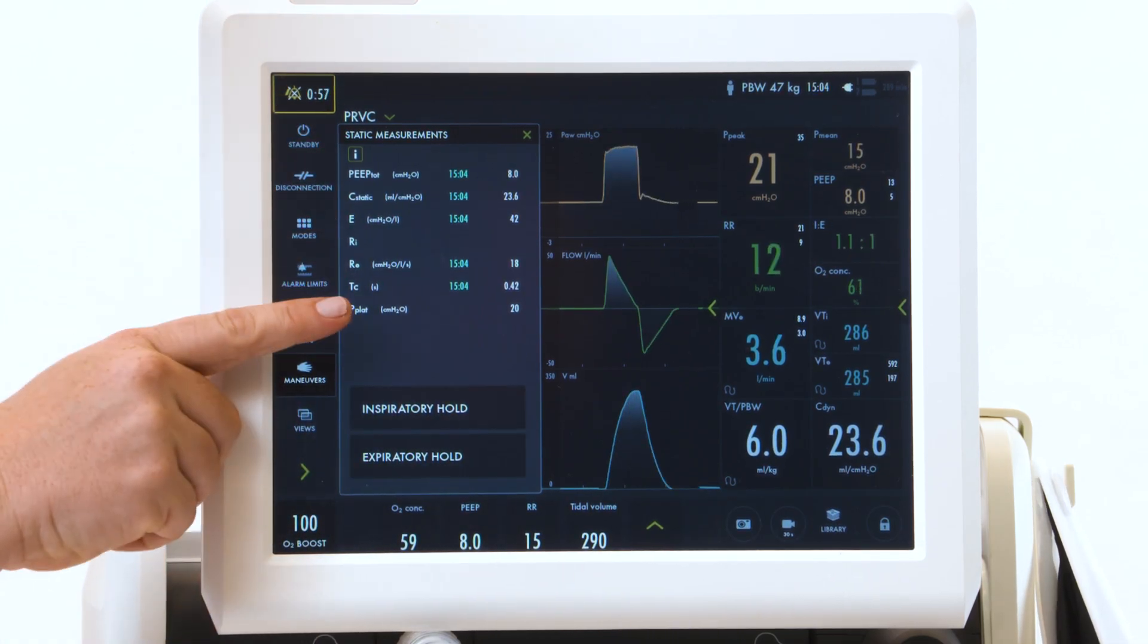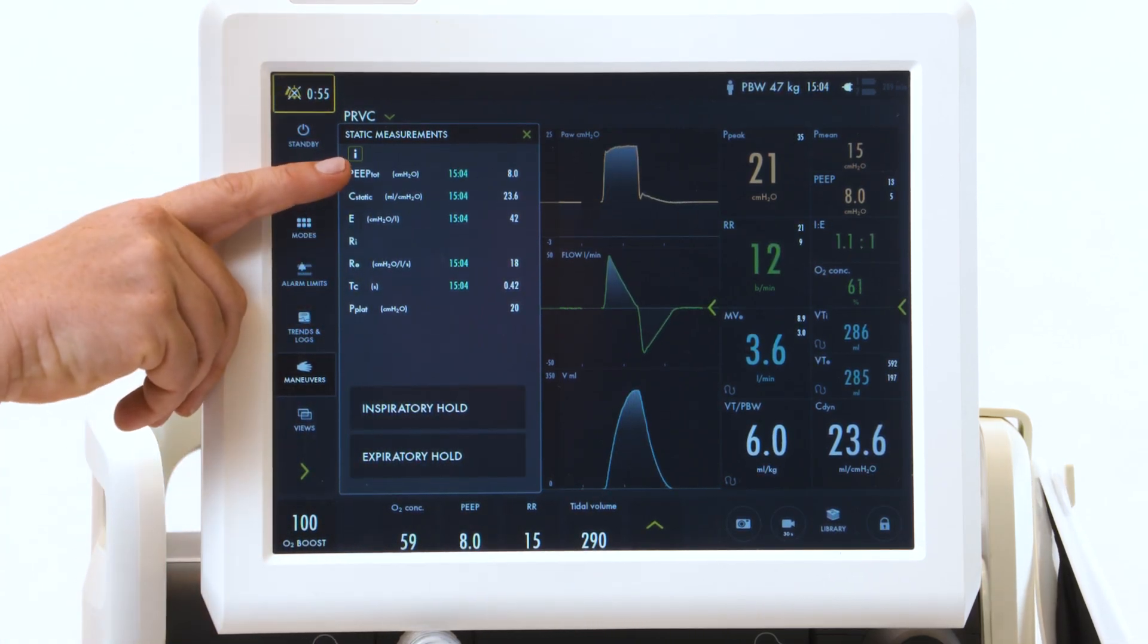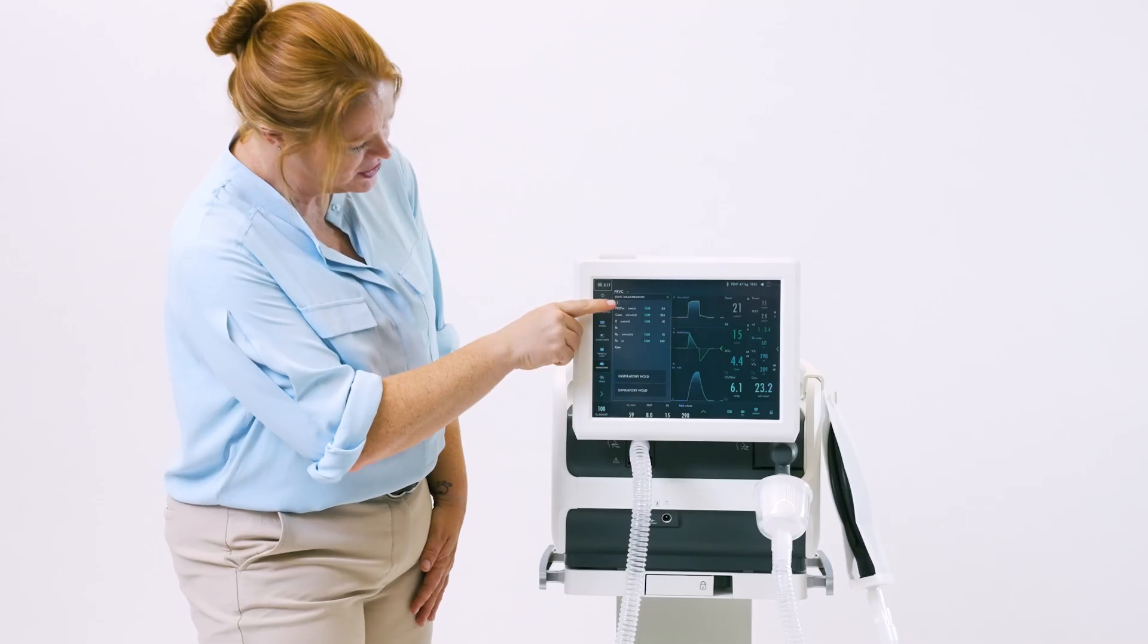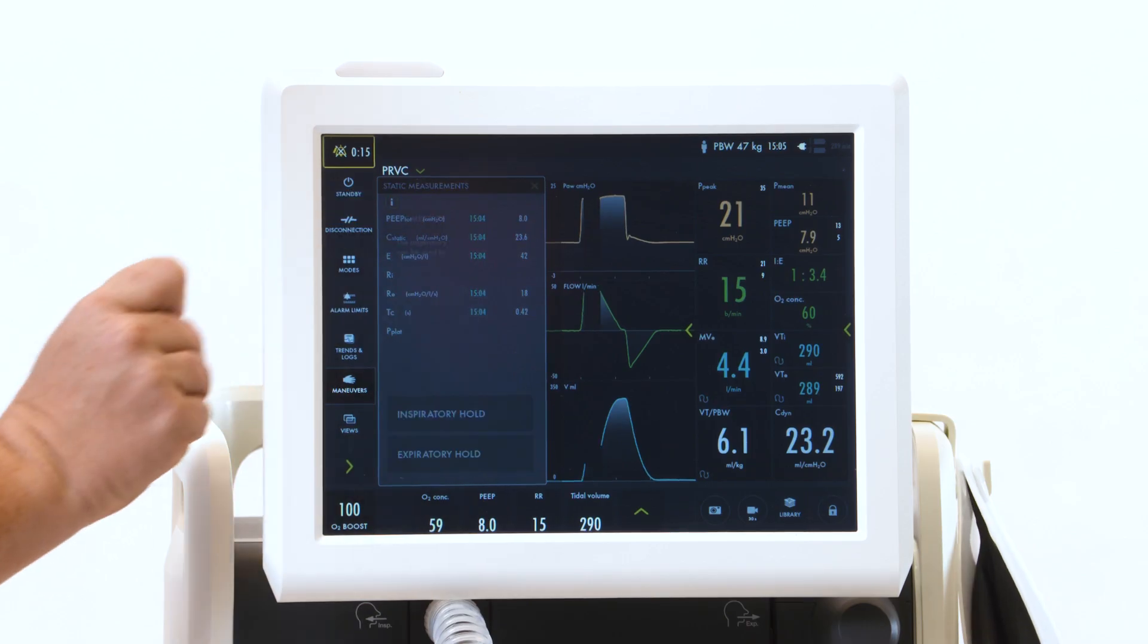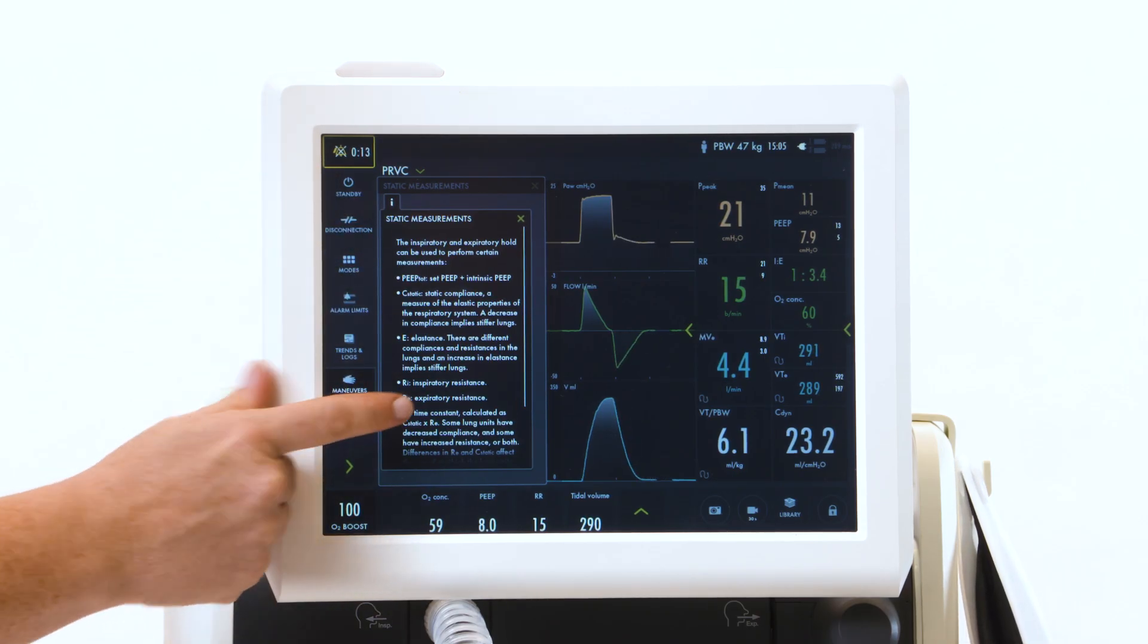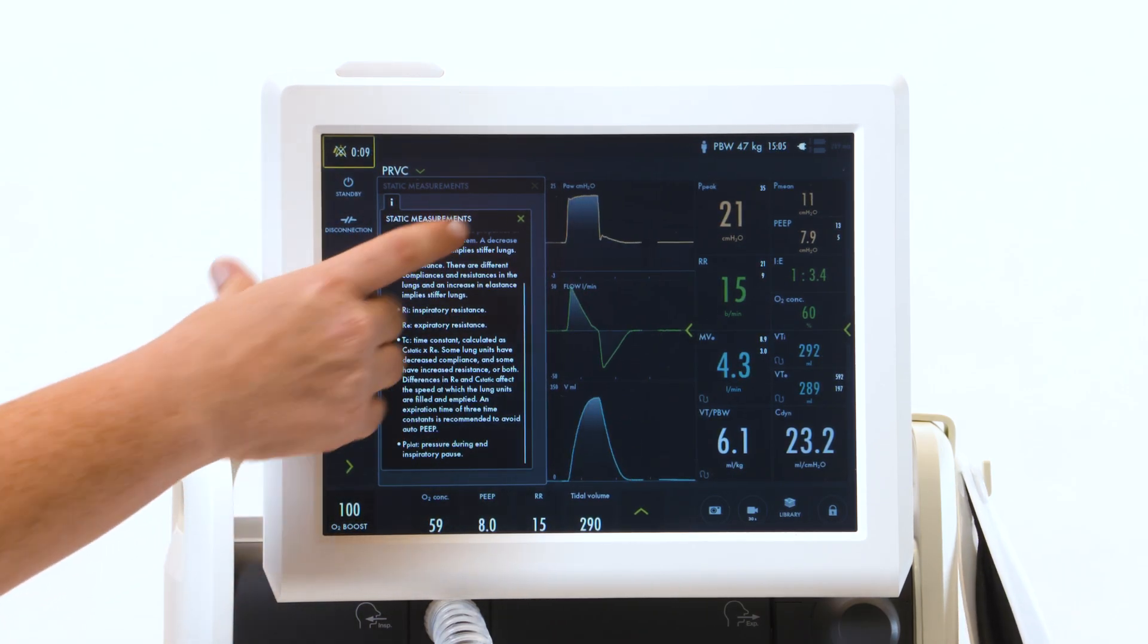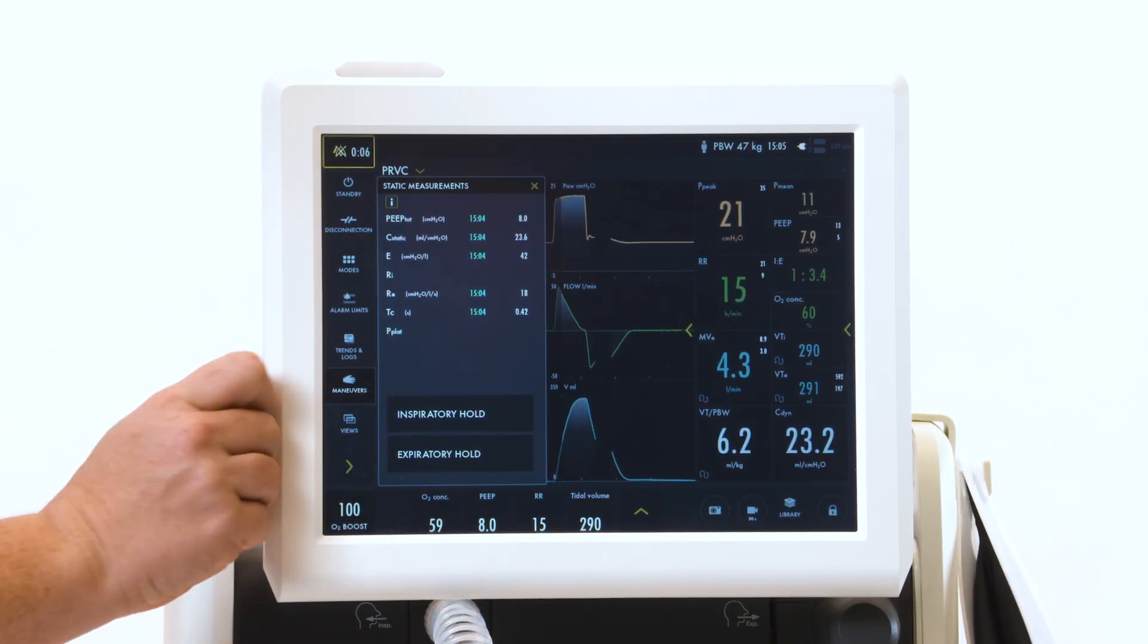Followed by an expiratory hold until it beeps and says active. Your numbers will appear including your total PEEP, your plateau pressure, and your static compliance. Under the eye are the values. You can scroll to get the definitions of all the values which are measured underneath your measurements.